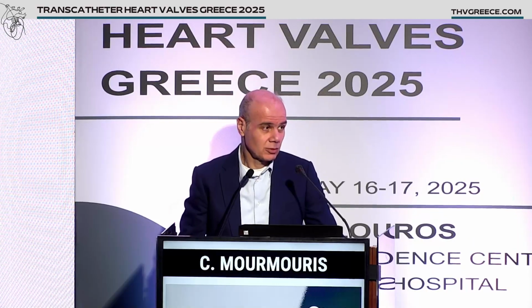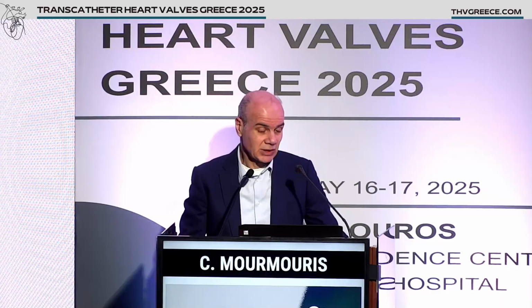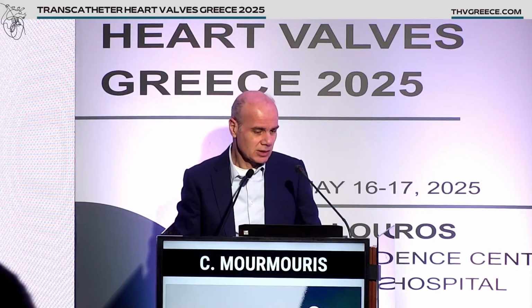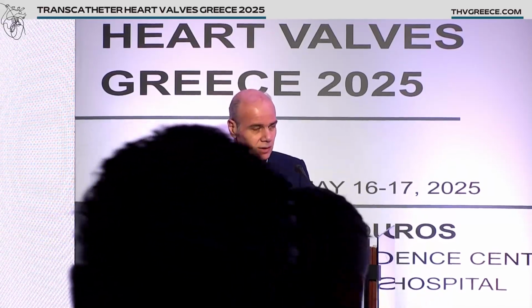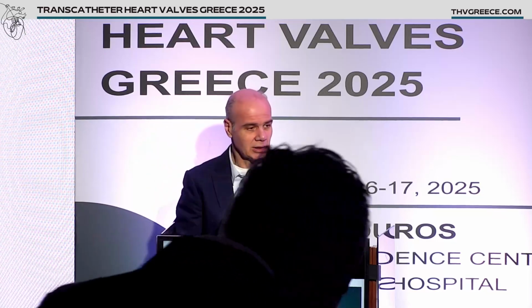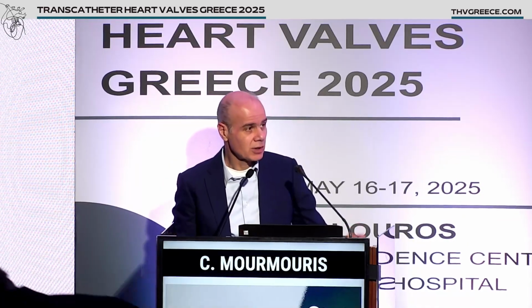I think the photon counting CT can provide significant details about the structures, with better quality. Also, the spatial resolution is very small.